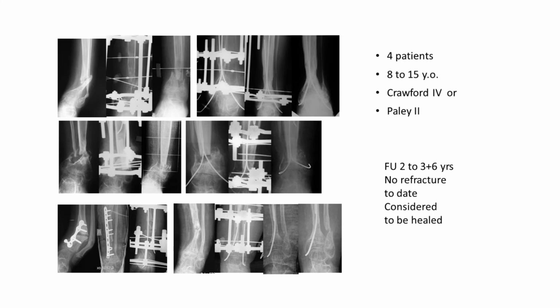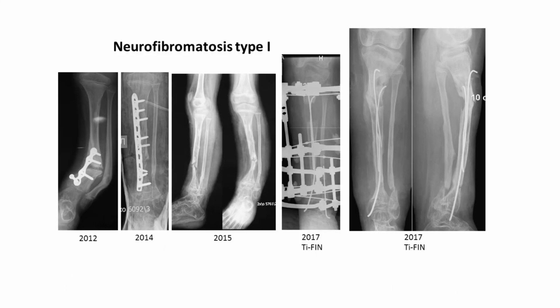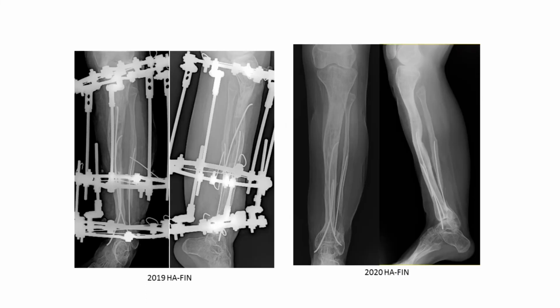For example, in this case of CPT Crawford 4, all previous surgery failed. We performed lengthening, simultaneous lengthening, and resection of hamartoma and sclerotic ends of pseudarthrosis. And finally, you see we achieved lengthening and bone union at the distal third of the tibial shaft. One year after frame removal, this patient is considered to be healed.